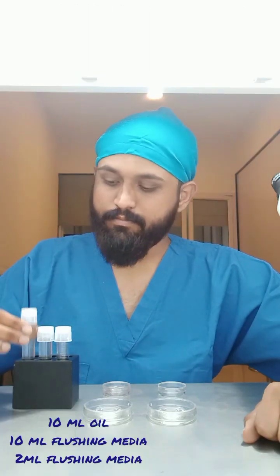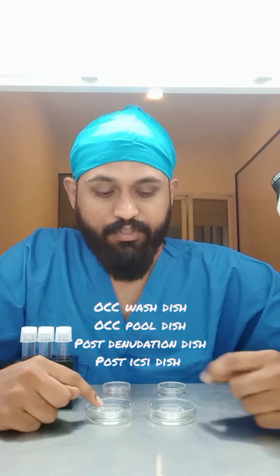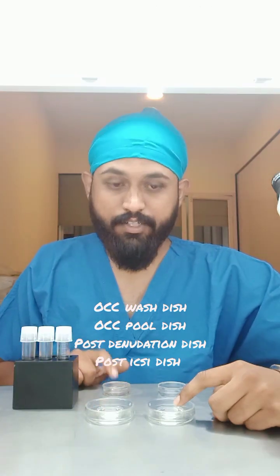Day minus 1. We need to keep all the flushing media and culture media for calibration at least 4 hours prior to the case. So for convenience, we keep the media for calibration the previous day. I keep 3 tubes and 4 dishes for calibration the previous day. 10 ml of oil, 10 ml of flushing media, and some flushing media to give to the gynecologist when she's doing the oocyte retrieval. The 4 dishes are OCC wash dish, OCC pool dish, post denudation dish, and post ICSI dish.